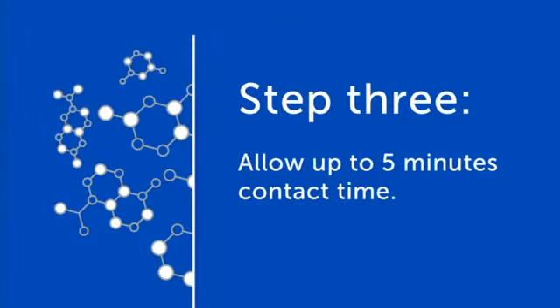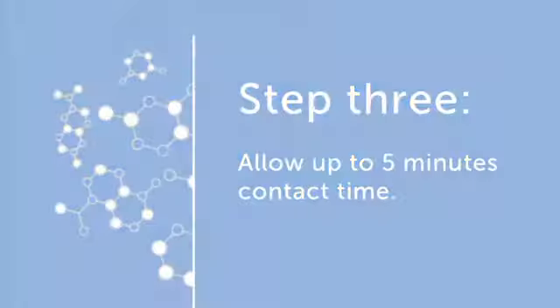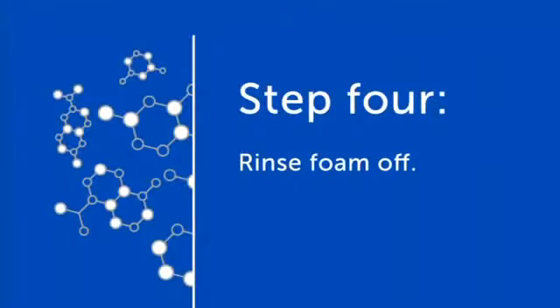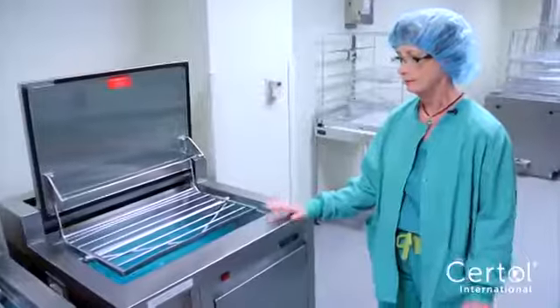Step 3. Allow up to 5 minutes contact time, but with light soils, 1 to 2 minutes is sufficient. Step 4. Rinse foam off with cold water prior to placement in automatic washers or ultrasonic instrument cleaning tanks.